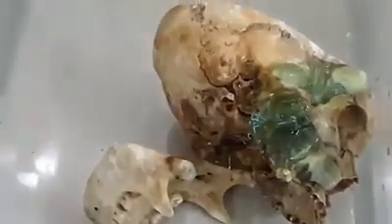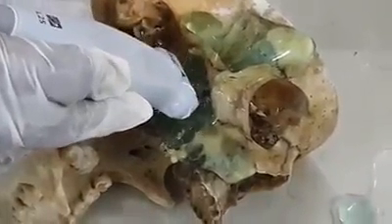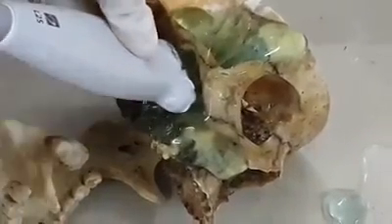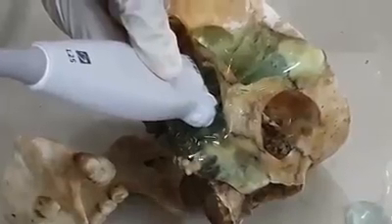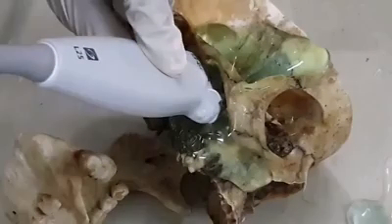Copious amount of jelly is put superior and inferior to the zygomatic arch so that air shadow doesn't obstruct the vision of the ultrasound. Keep the probe over the zygomatic arch and then slowly slide the probe inferior to the zygomatic arch and tilt the probe cranially so that the beam goes under the zygomatic arch.